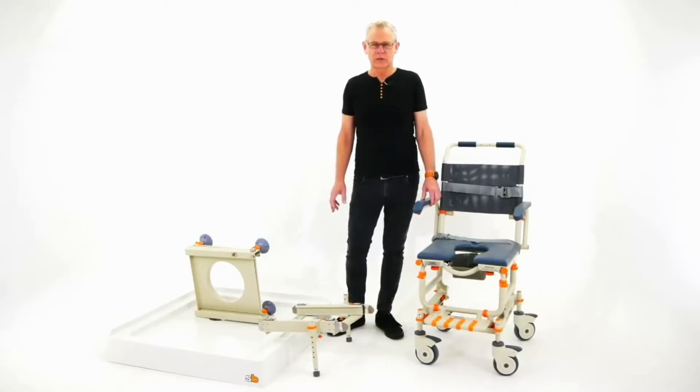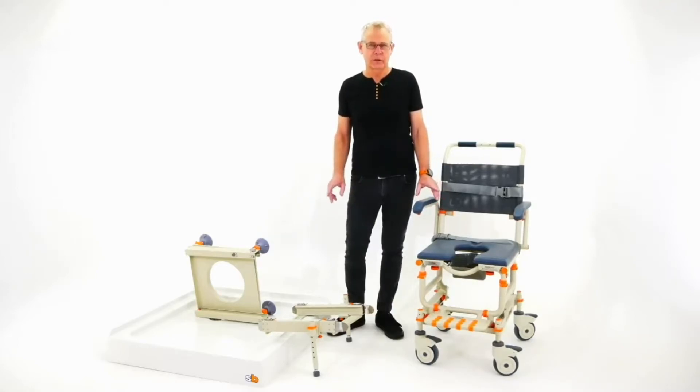It's been in existence for 10 years, award-winning, with worldwide patents — and it's a great product. So let me show that to you.